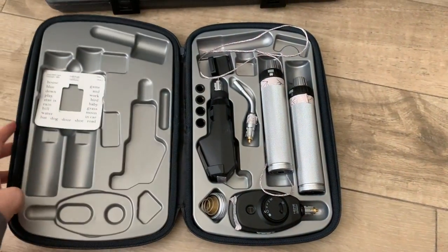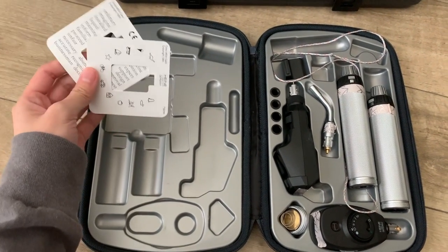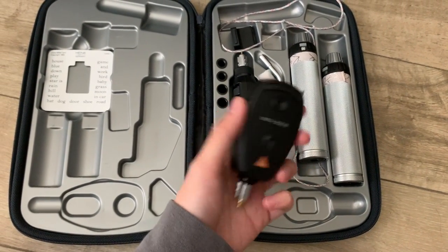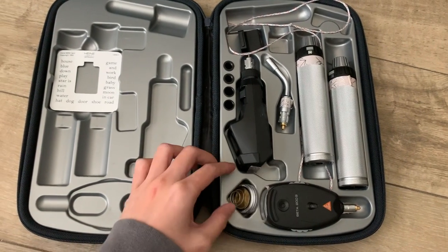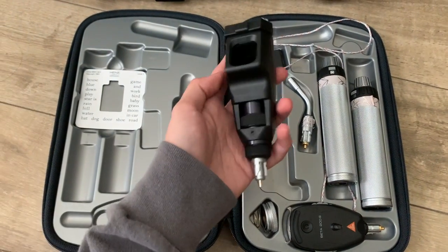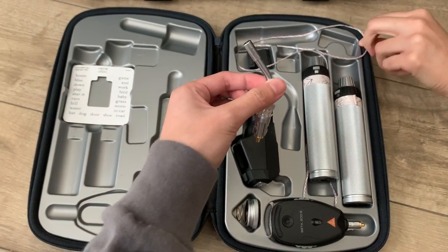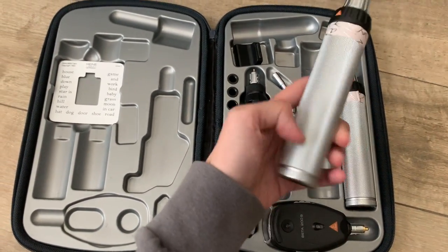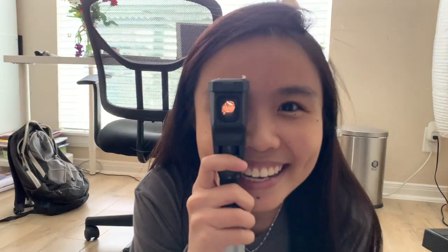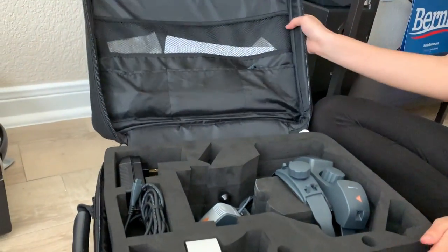Here's the retinoscopy kit I mentioned earlier — that was about $1,100. Here's what we use for MEM, and here's the dot attachment. Here's the retinoscopy handle, and here's the transilluminator. Here's me putting the retinoscope together. We also have the BIO 78 lens.